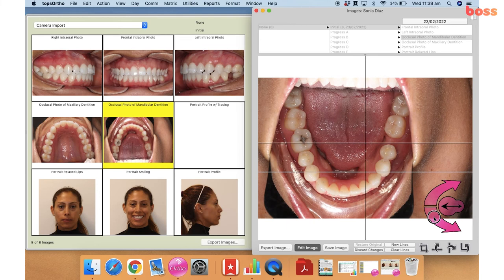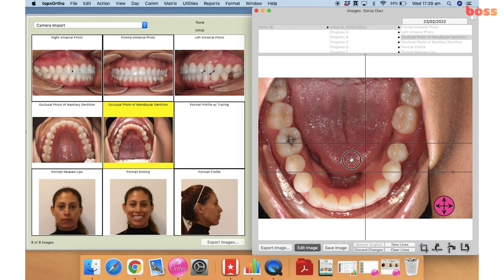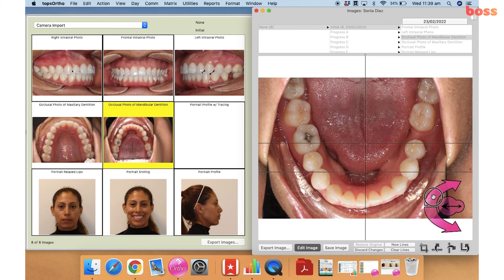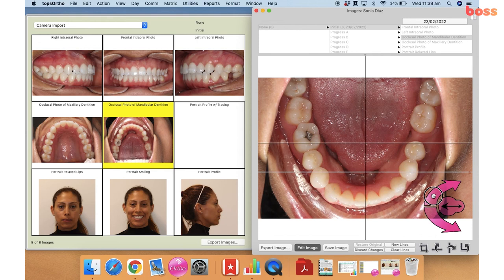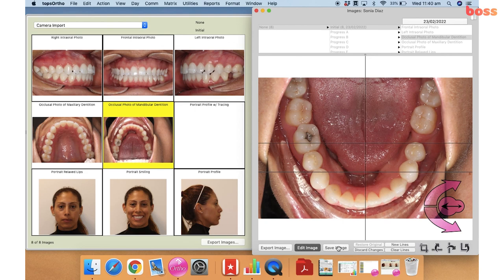Again with the lower shot we're going to flip it first, then just rotate the image a little bit, zoom in, and center the image. If possible, we will have the line running through in between the lower central incisors. And that's how we edit our photos.